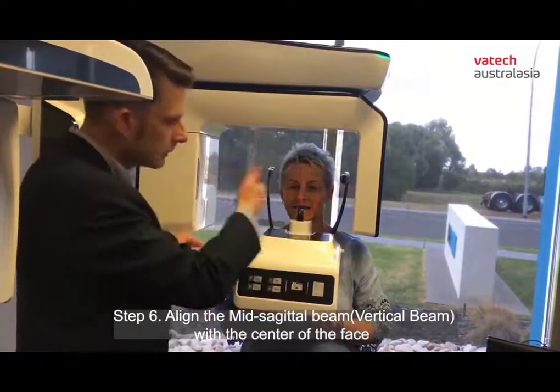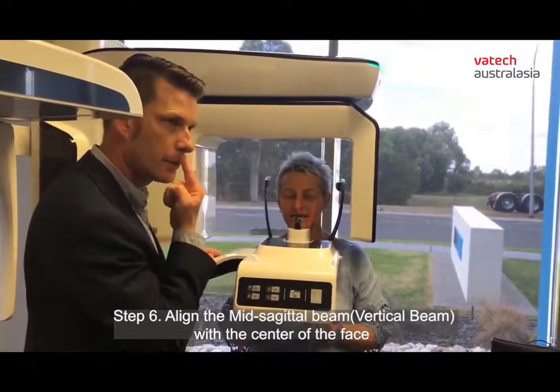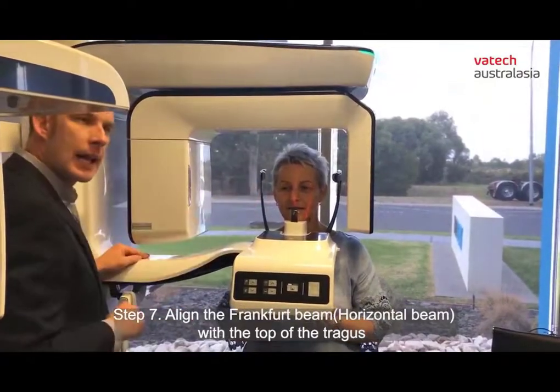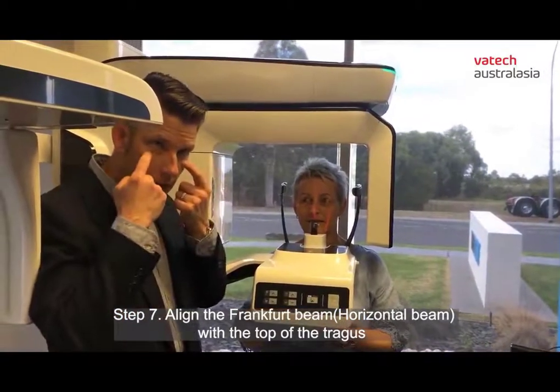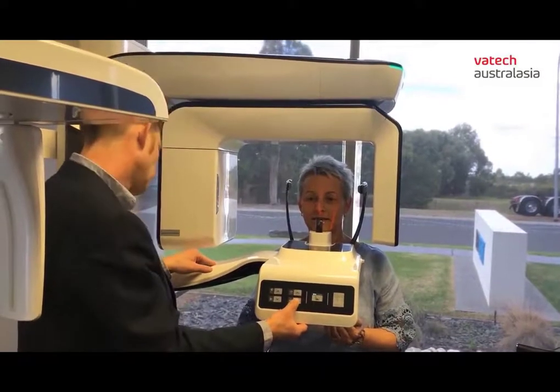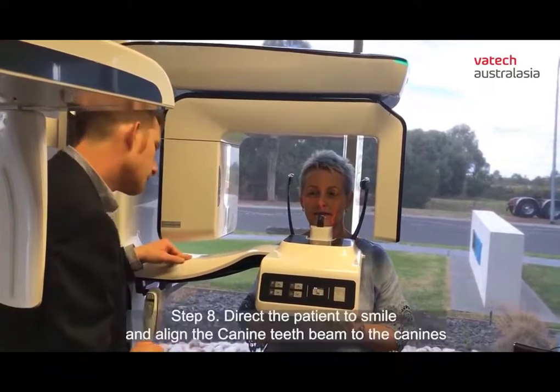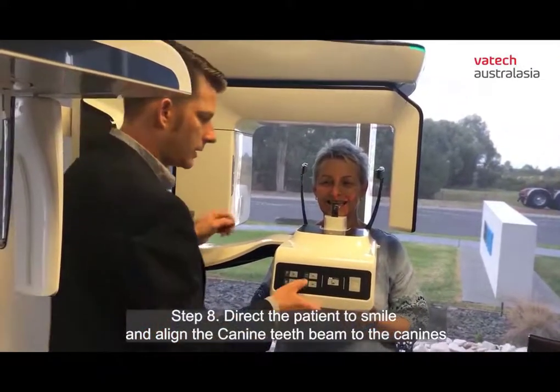So now I'm looking at the mid-sagittal beam. We're going to get that pretty close, right between the eyes, right through the philtrum. And then next I'm going to look at my Frankfurt horizontal beam. I want to put that right at the top of the tragus and then to the infraorbital notch of the eye. So I can move that right here by this beam, and say right about there. Smile really big. What I might do is tip you down just a little bit more.